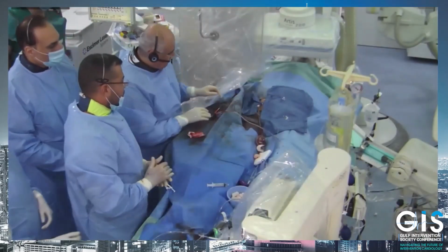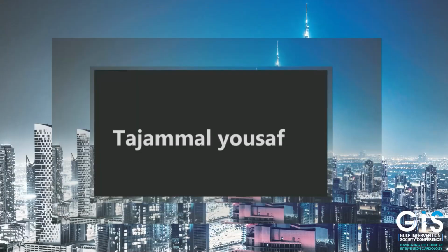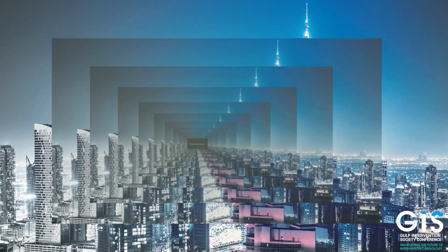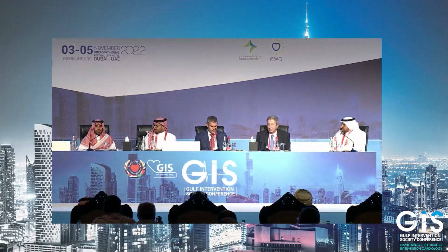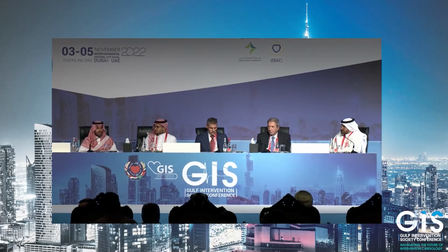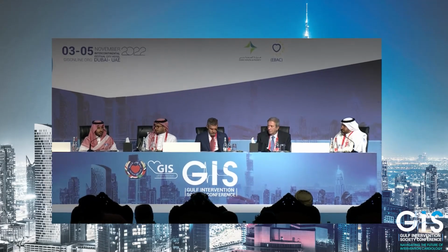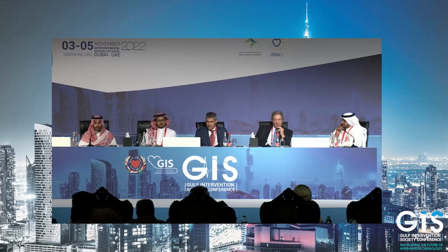Just a comment. I think the case was well planned, well done. You do have a severely depressed LV function. You do have a CTO RCA, heavily calcified left main tail. LAD mechanical support was used, and was an excellent choice. You do have a heavily calcified LAD with 180-degree calcium in the ostial LAD and deep calcium, and the debulking decision was made, and that's an excellent choice that they used Shockwave. We had an excellent final result.